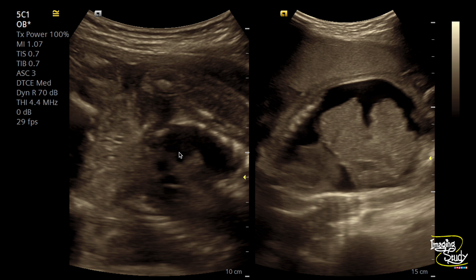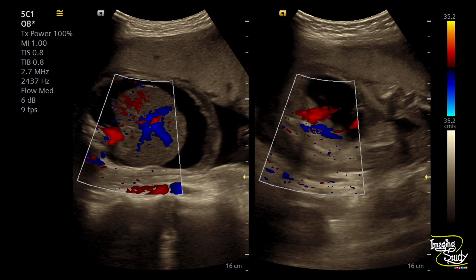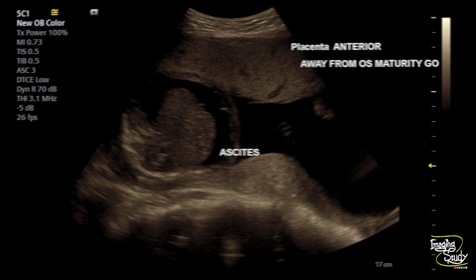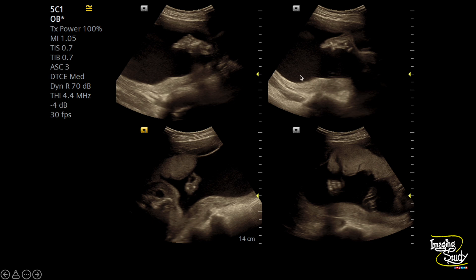Another picture shows pleural effusion with generalized thickening of the fetal skin. On color Doppler imaging, you can see very prominent hepatic veins, which drew our attention and led us to suspect cardiac abnormality — especially cardiac failure. There was an increased amount of amniotic fluid, and fetal ascites was present. You can see four pockets showing a huge amount of fluid.